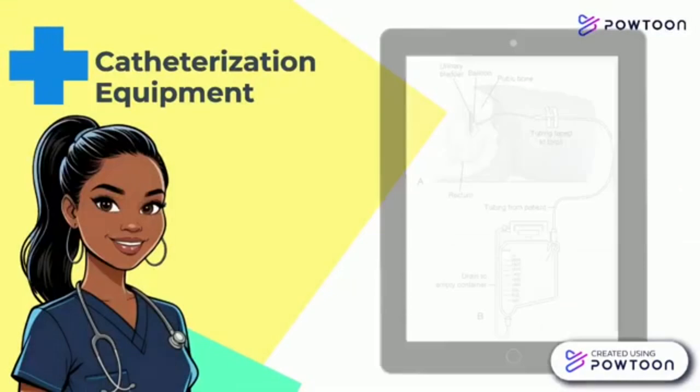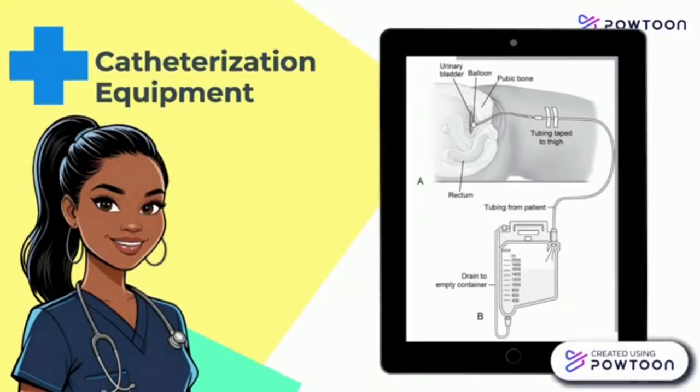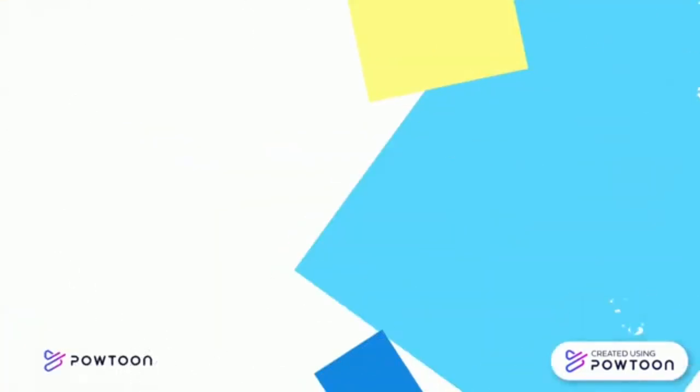This diagram illustrates the catheterization equipment used in urinary drainage. The tubing connects the catheter inserted into the bladder to a drainage bag. The balloon, when inflated, holds the catheter in place inside the bladder. The drainage bag collects urine and is typically secured to the patient's leg or bedside for monitoring and disposal.